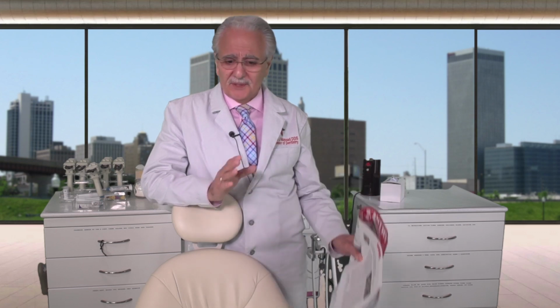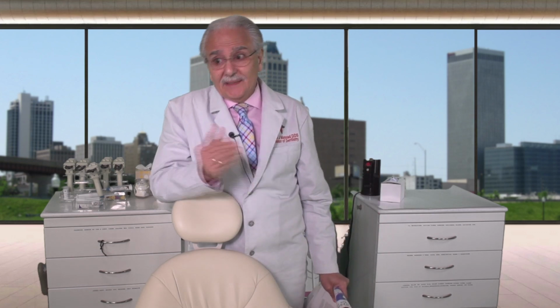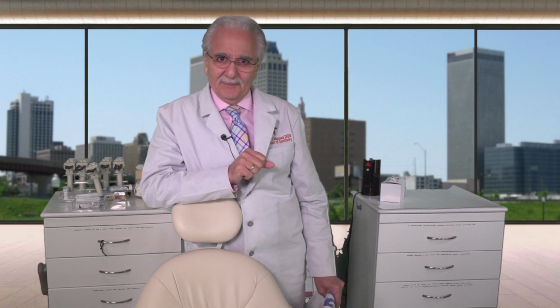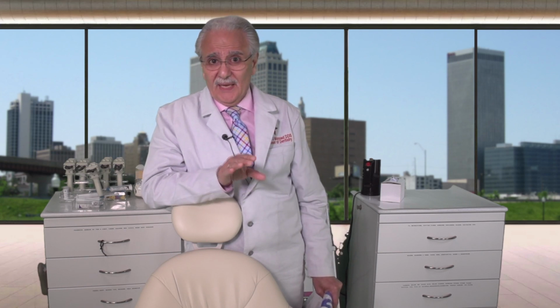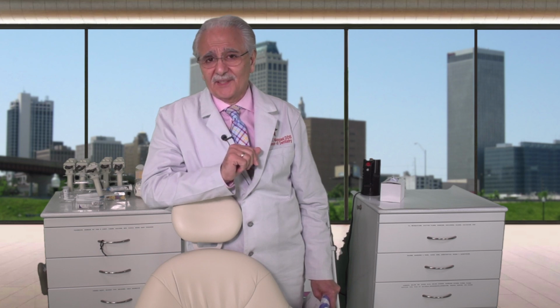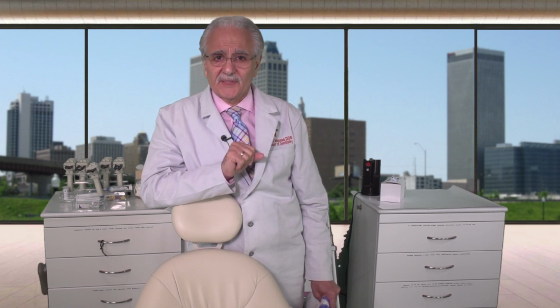And so I'm going to explain in this particular article a case that I did diagnose correctly. It was diagnosed right, but unfortunately I didn't know the surgeon who was putting in the implants, and he actually put in bone graft procedures and built the ridge up. And by the time the implants were placed, I only had 4 millimeters or so of space. And so you'll see how I had to negotiate that particular case. Tough case to do. It was out of my hands, and I want you to make sure you are always involved in all of these cases.